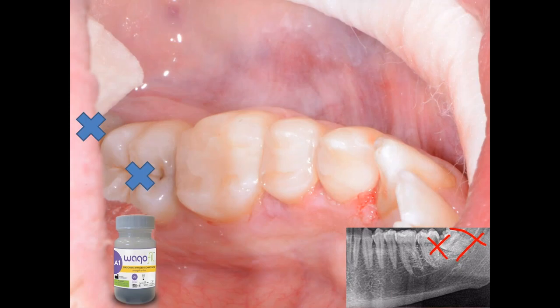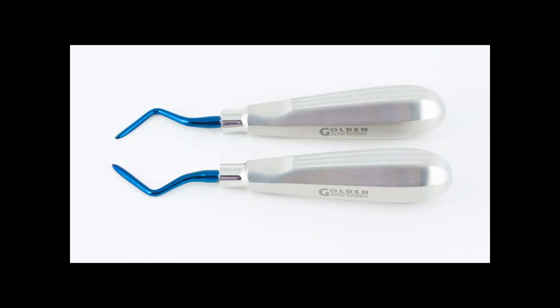Now notice, we used the A1 shade, and we can see where the composites are. Now, this is magnified for our patients when they look in their mouth. They just see white teeth. They don't notice the restorations. So I actually prefer the opacity of this as compared to layering composite restorations up, because then you start to see the underlying darkness of the dentin. This makes it very easy to do a bulk fill, and you're done with these three restorations in a short amount of time. Here we're going to remove the roots.